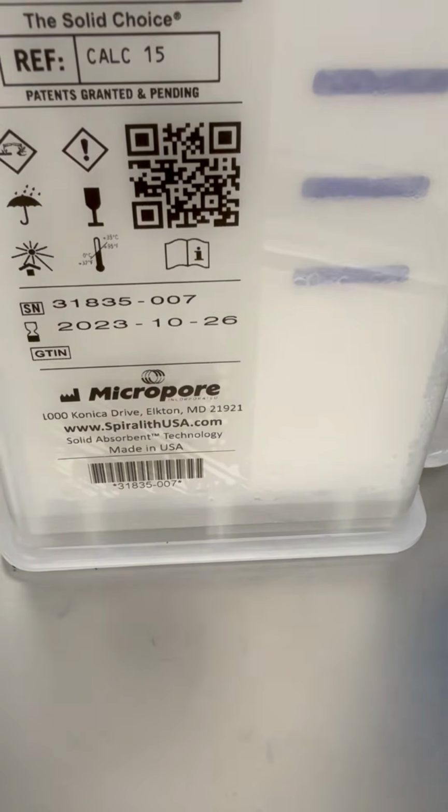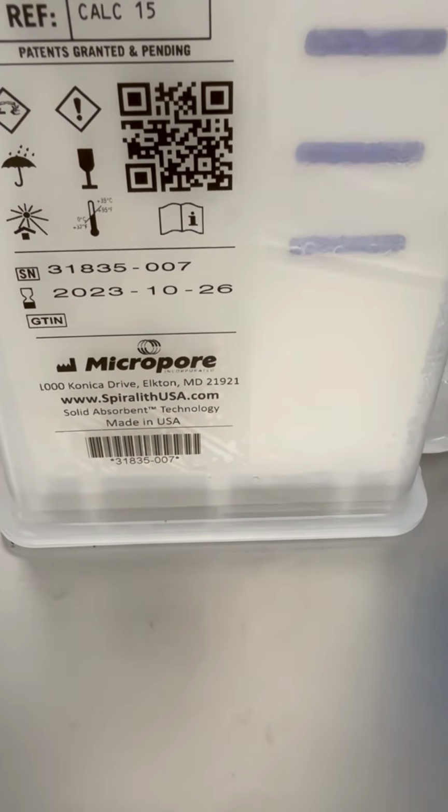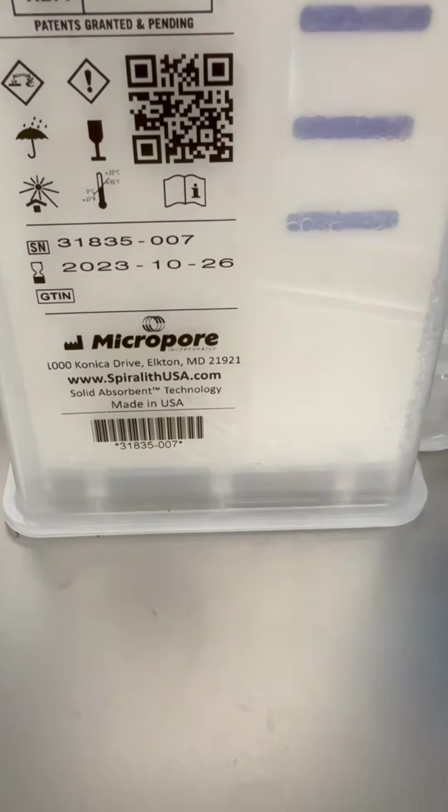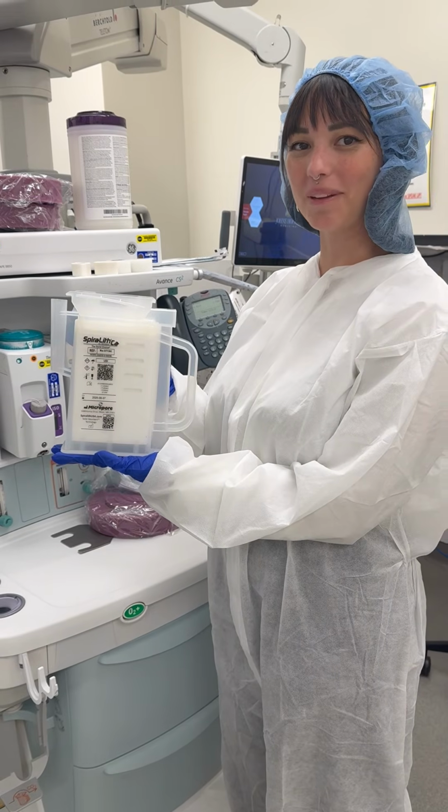If you have water traps, don't forget to empty out your water traps and clean the components as per your machine operating instructions. Thank you for using SpiraLith Ca solid absorbent technology.